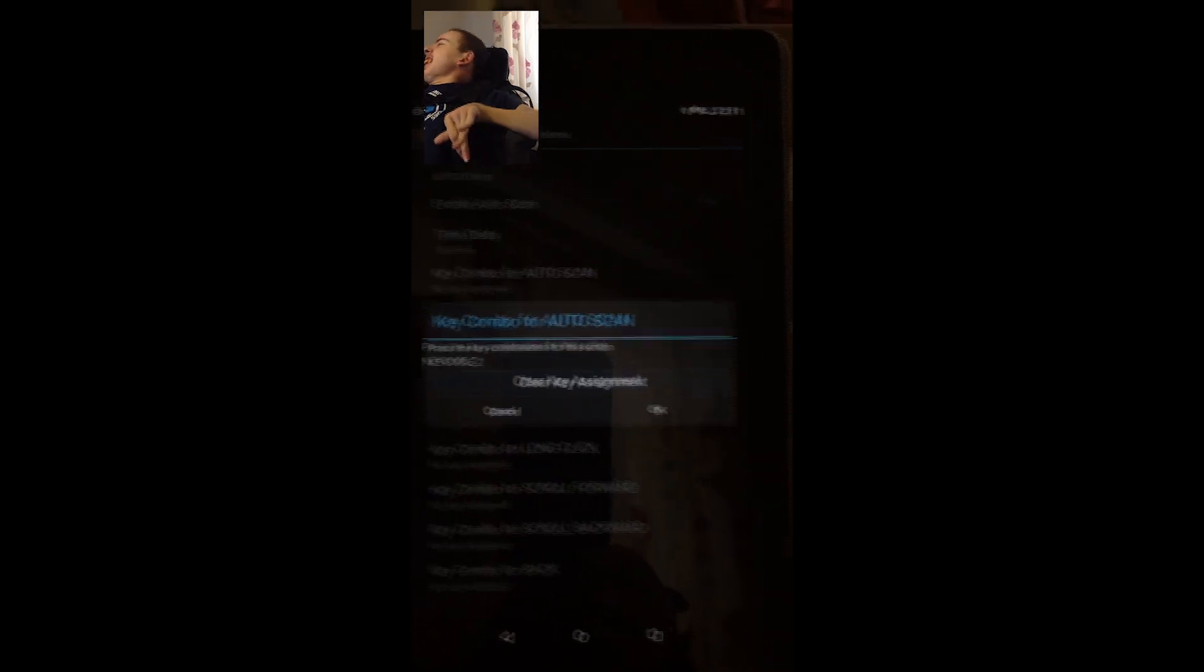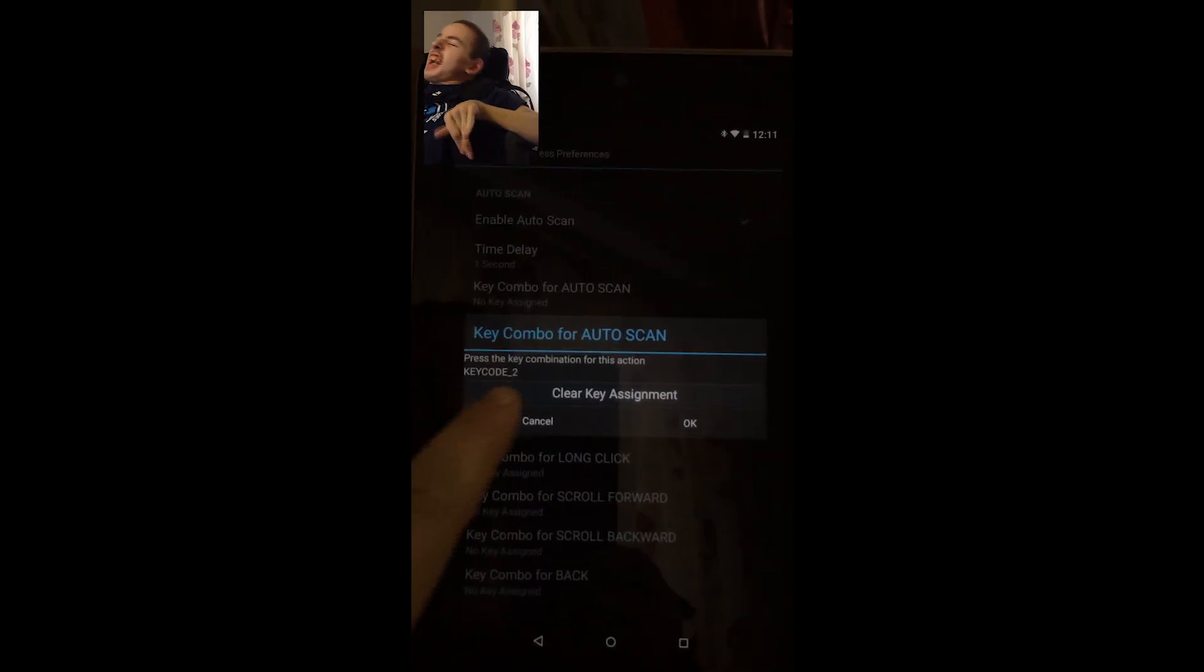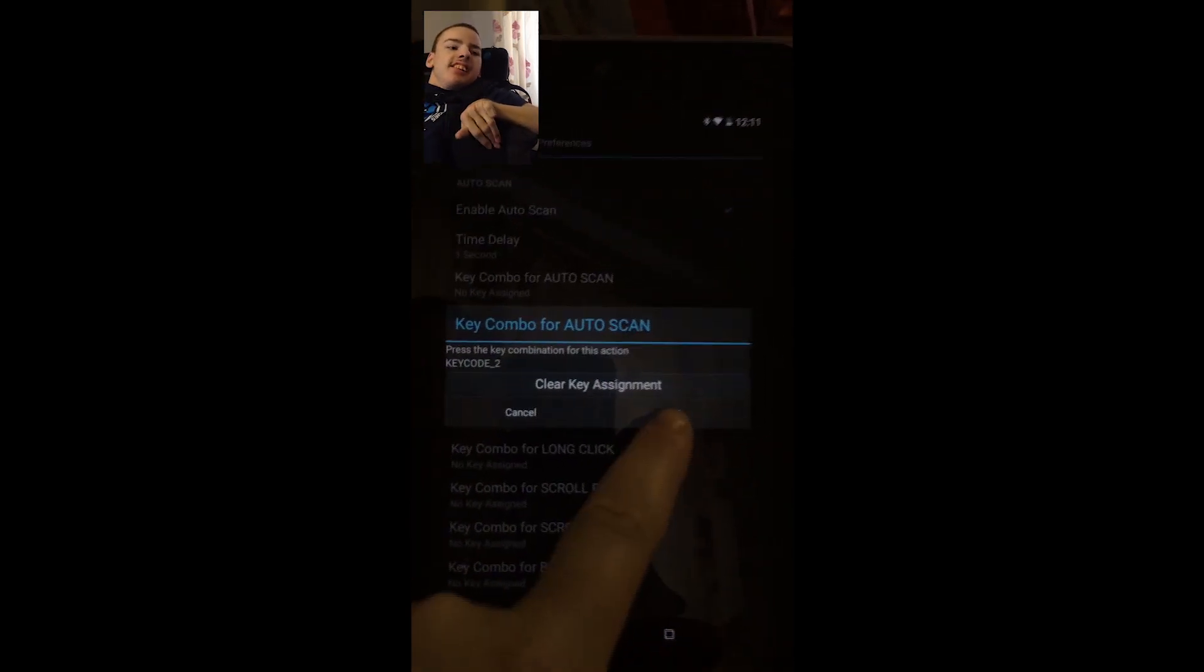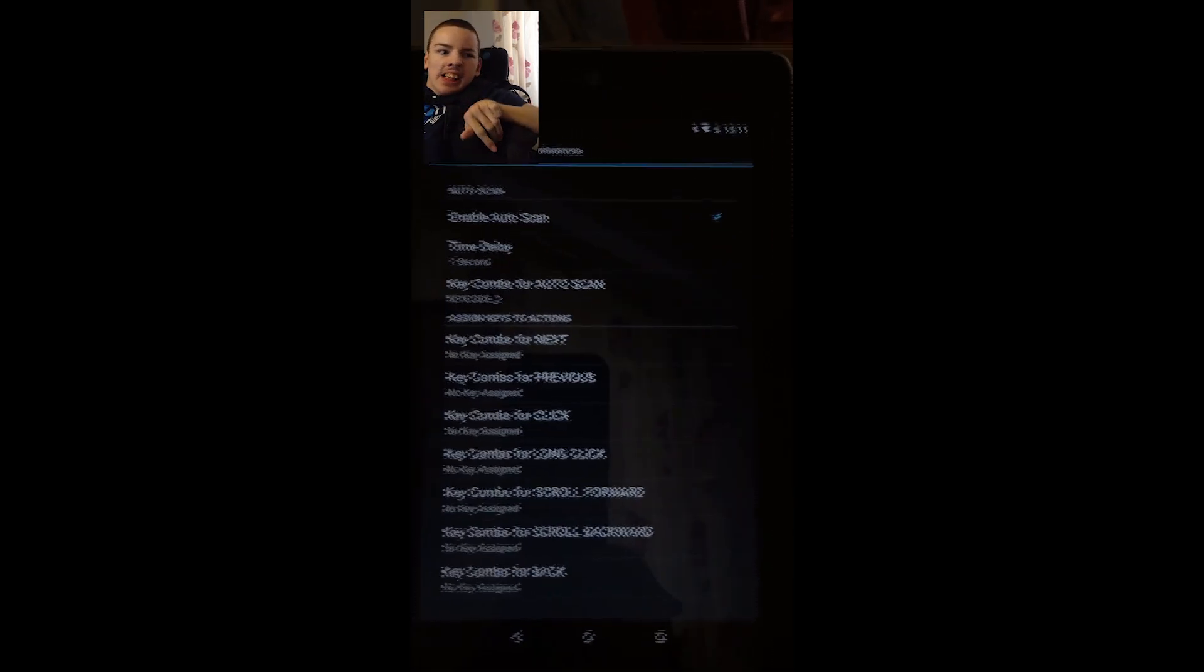Right, he's just hit his switch. And that's now come up with key code 2. So we should press OK now.